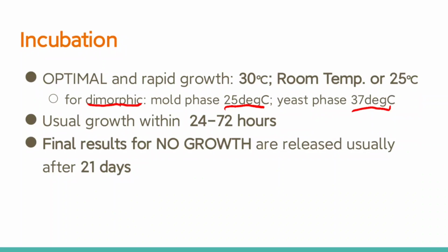However, always remember that there are different and multiple growth patterns, especially in the hours or incubation period of fungal specimens. It varies. But we will base it on Mahon, within 24 to 72 hours.